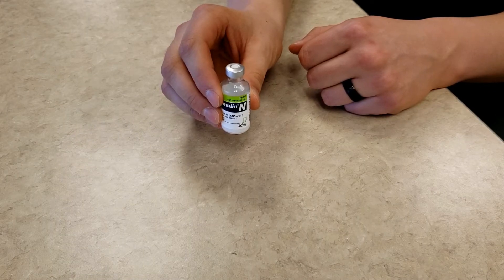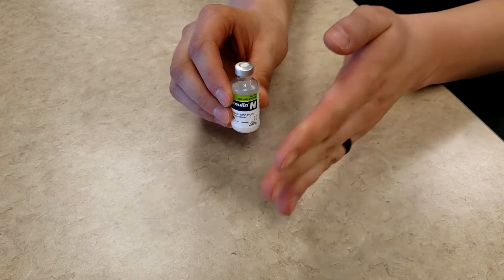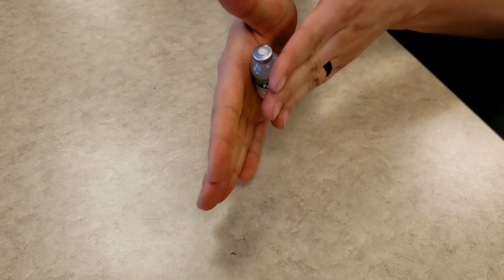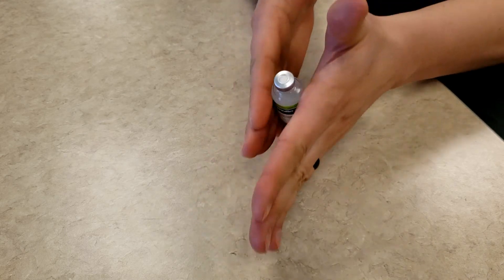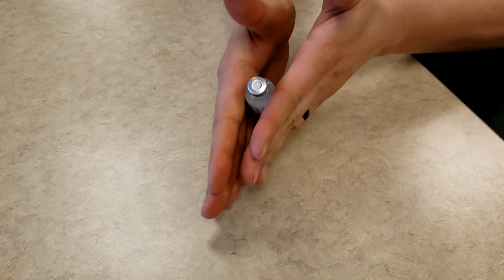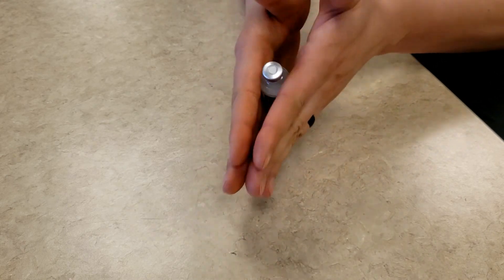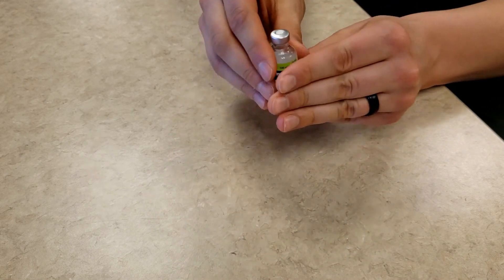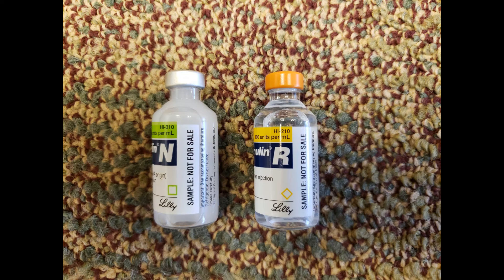If the insulin that you are using is NPH or N-insulin, the second step is to take the bottle of insulin and roll it gently for about 10 seconds. As you can see, NPH insulin is cloudy in comparison to other types of insulin. Mixing NPH is a necessary step to ensure that the medication is evenly dispersed.